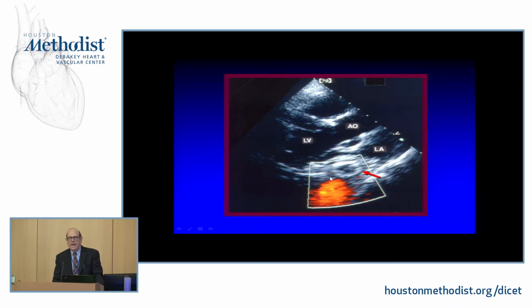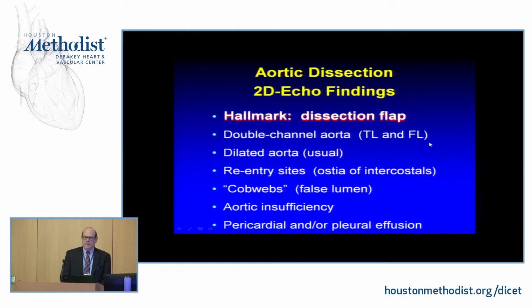This patient had cancer of the esophagus, and this is a plastic stent to keep it open, and it shows you how proximate we are to the descending and ascending aorta and illustrates why TEE can be so good. Echo findings, the dissection flap is really the hallmark of this diagnosis. And with transesophageal echo, these are normally a slam dunk, a piece of cake.